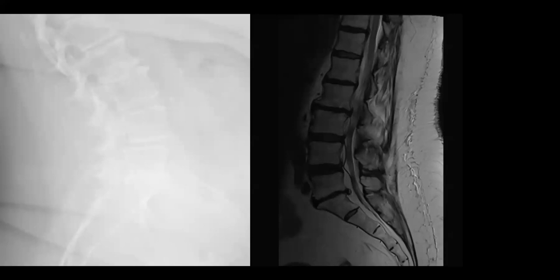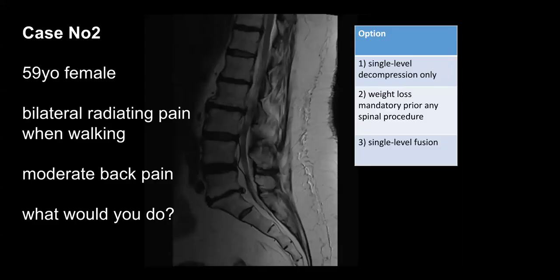Yes, the leads very much just go over the transverse process, targeting the medial branch of the primary posterior rami L2-3. So they're not going in the spinal canal at all. Yeah. So I go for here.